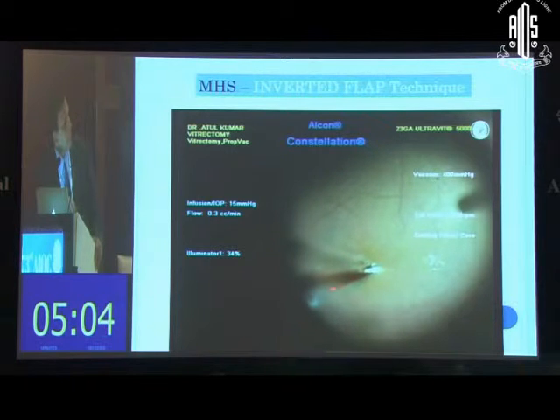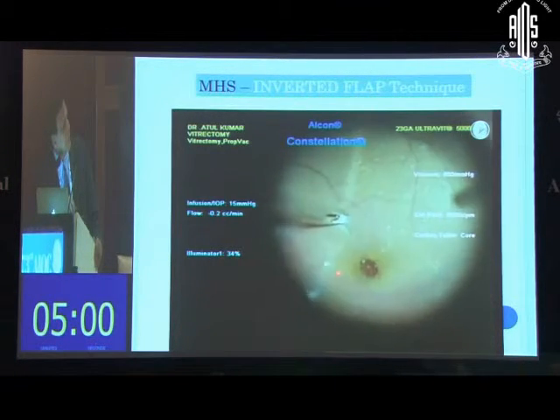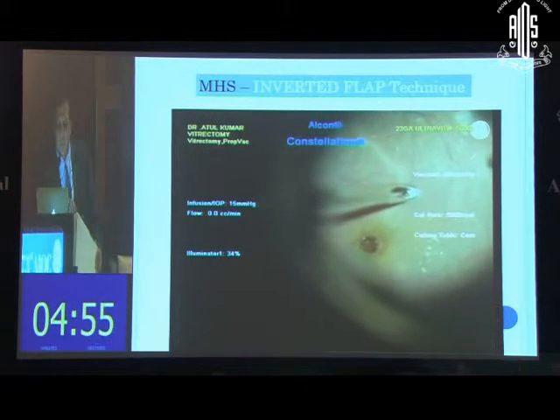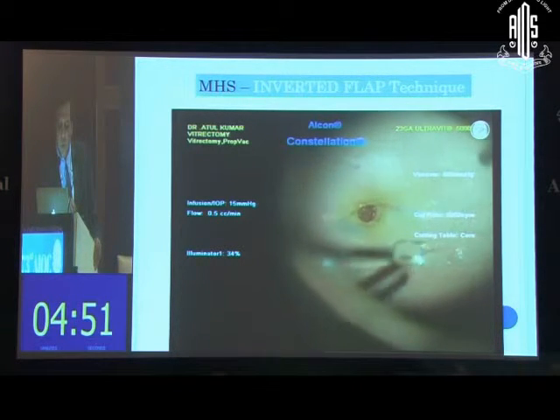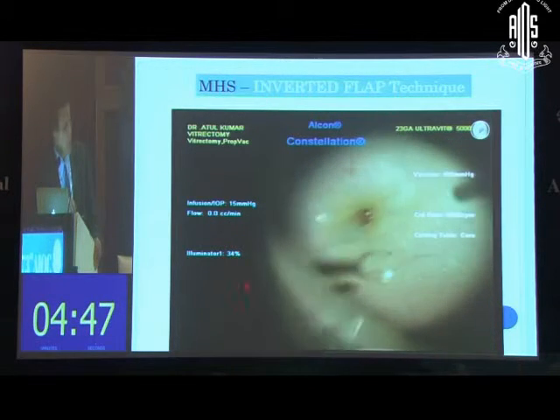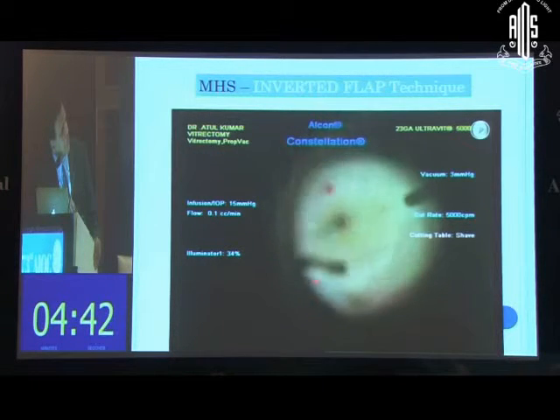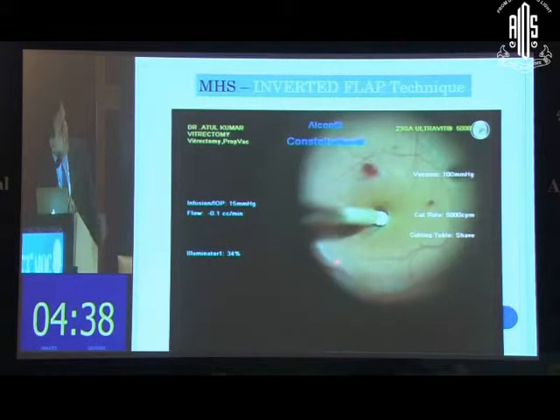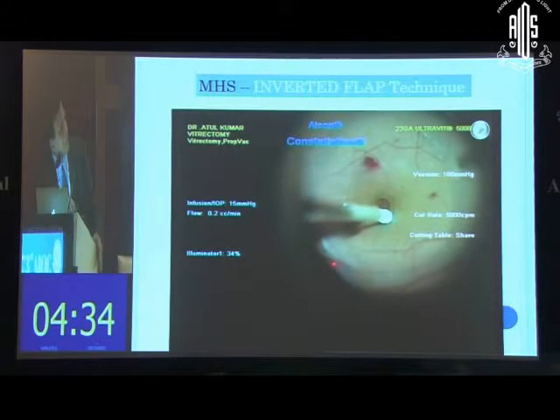We do it very often now at our place, and we put this first flap right across. It's lightly blue stained; the Brilliant Blue doesn't stain it dark blue. It's generally all around, close to the hole, to prevent the flaps from being lost or torn off from the edge of the hole. We tend to bring all the edges of the ILM close to the hole together, and then we trim off a couple of those flaps so that the remaining flap comes over it.